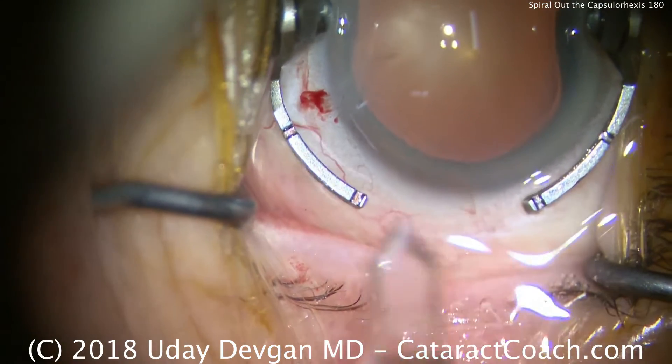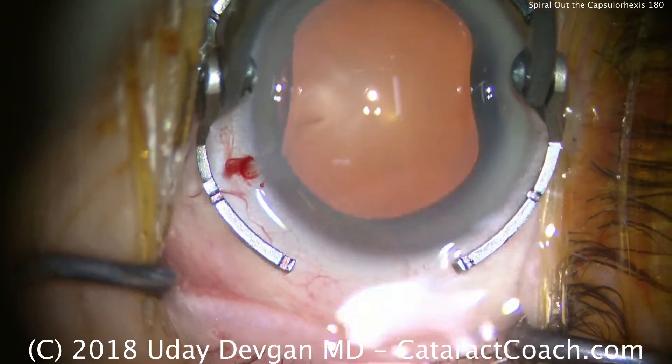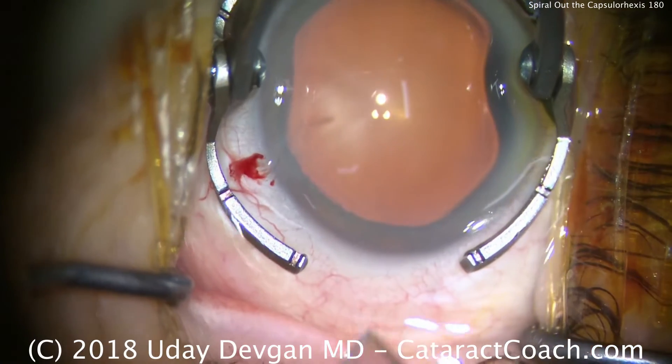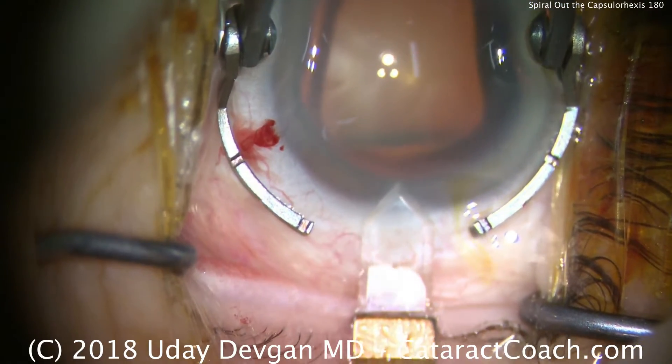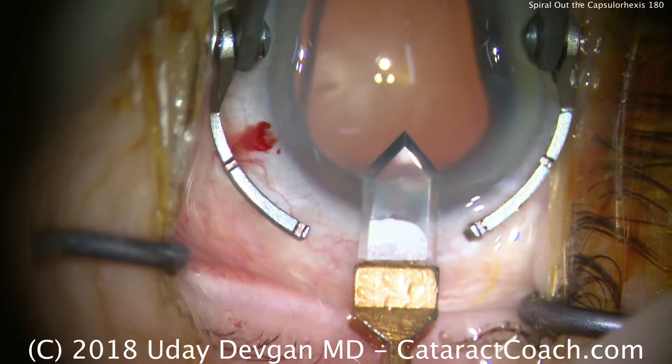CataractCoach.com. We're going to show you a technique of how to spiral out the capsulorrhexis. It's easier to start off making a smaller capsulorrhexis, and then spiral it out until the appropriate size.